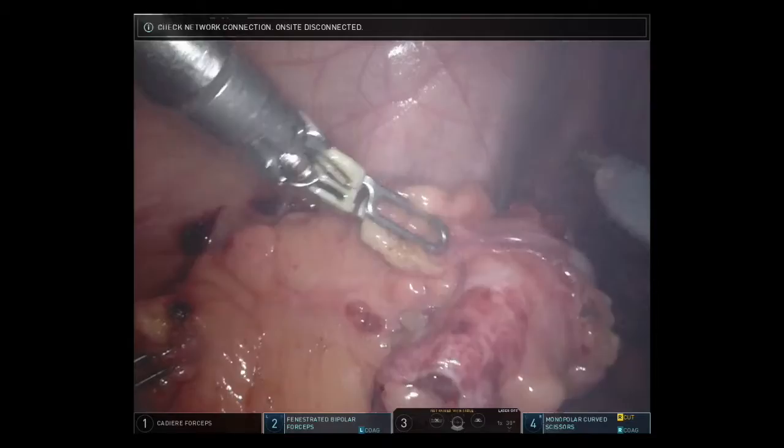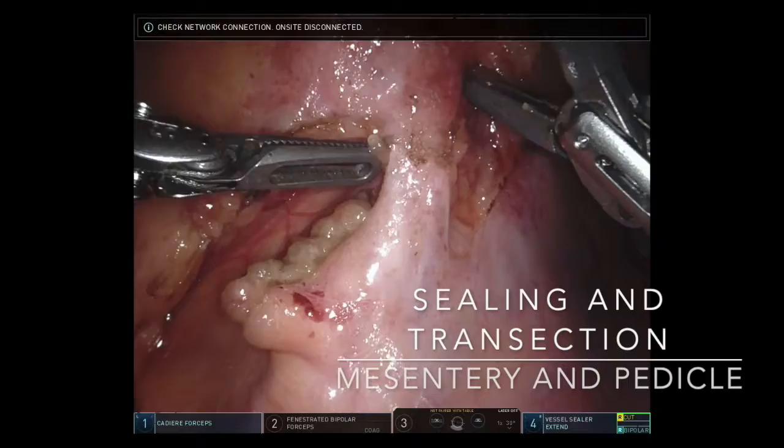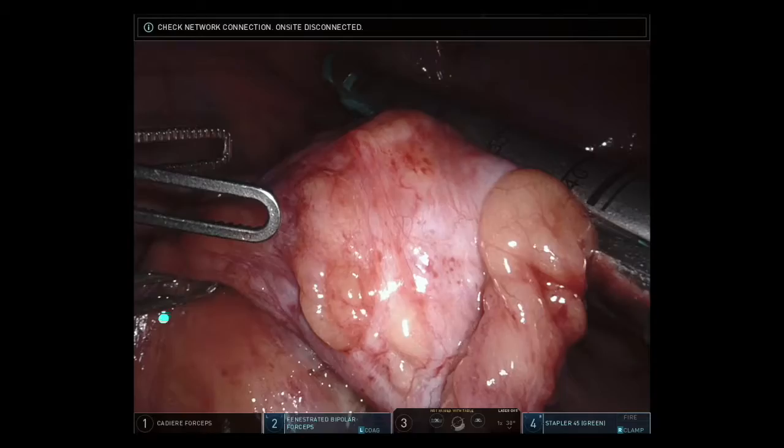We elevated the sigmoid stump and used electrocautery to perform the dissection of the sigmoid vessels. A window was made in the mesentery to help identify the pedicle. We switched over to the vessel sealer to seal and transect the mesentery up to the wall of the bowel and then to turn our attention to the pedicle. The sigmoid vessels were sealed and transected with two firings of the vessel sealing device.